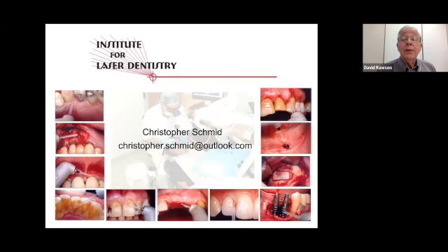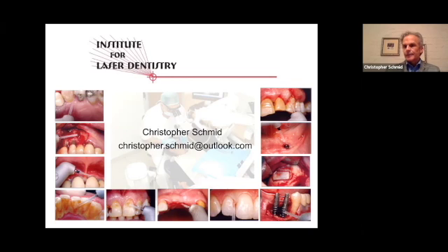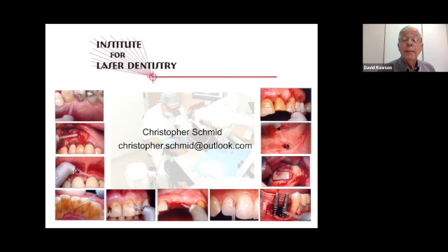Is the CO2 laser the one you'd prefer to use for a lingual frenectomy release, given the blood supply being close by? CO2 for lingual frenectomies, tongue-tied patients. Yep, the CO2 works perfect for tongue-tied patients. It's very quick. I would say yes. Yeah, absolutely. There's probably thousands of users out there, and they use it on frenectomies all day long. So yeah, it would work very well.